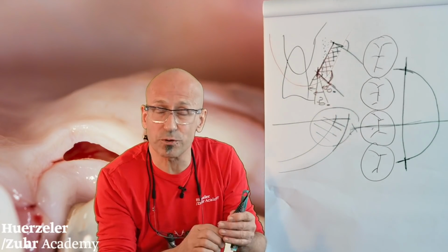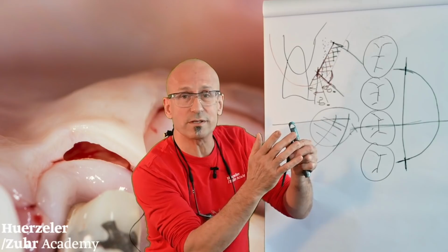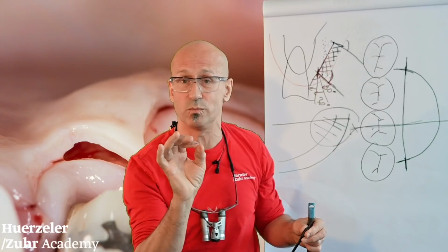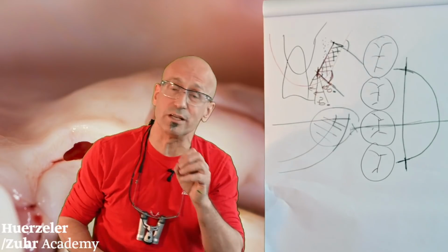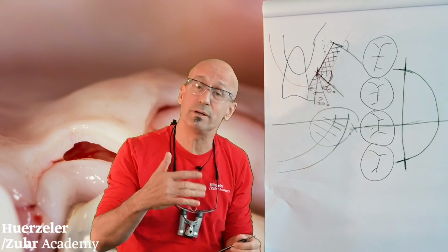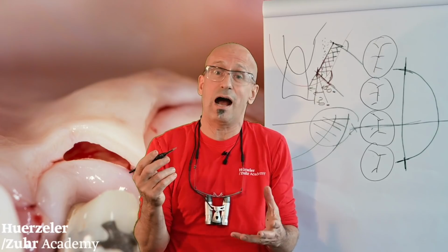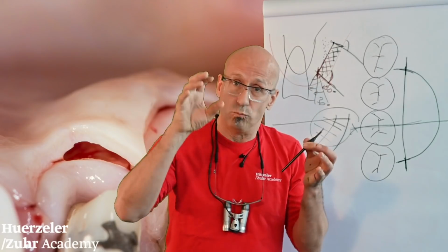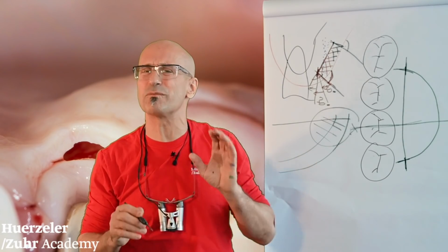Great help from the prosthetic literature to help us as surgeons. The moment when the blade is shining a little bit through the tissue, I have the perfect thickness which we want to achieve. This is going to be a little bit difficult on the apple, because no study was done on the apple, so we don't know when the blade is shining through. So this argument you can only use on a patient when you work in gingiva. Here it is a bit more difficult, but it's a wonderful exercise.